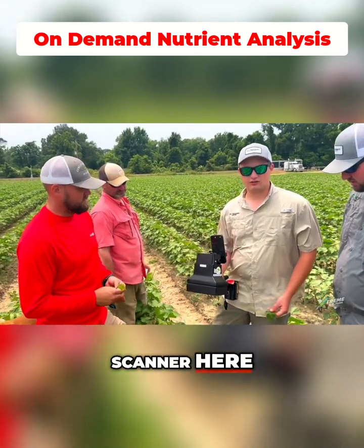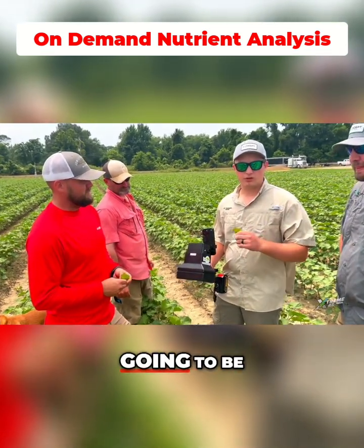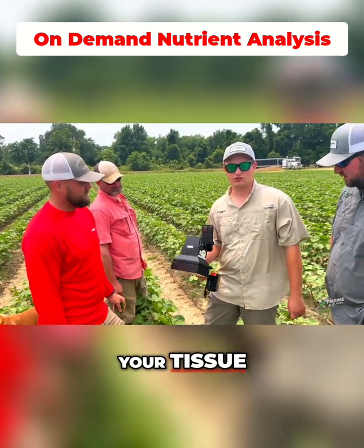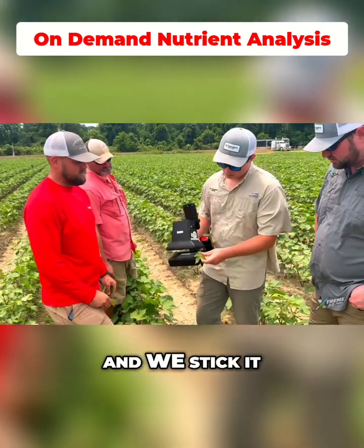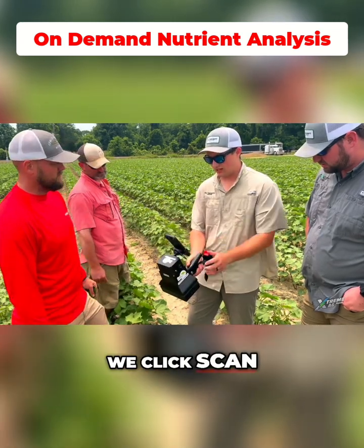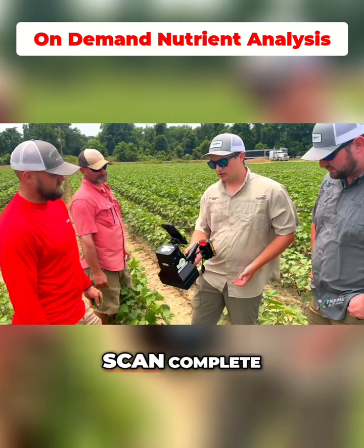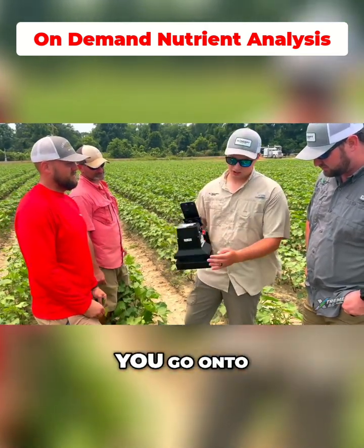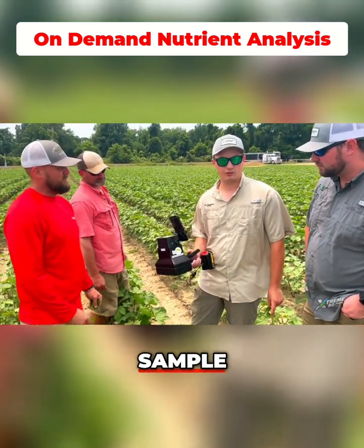All right guys, so we've got our Leafe Tech scanner here. Pretty much how this works is we pull the same leaf that we're going to be tissue testing if we send it off to Midwest Waters or wherever you send your tissue tests. We pull this leaf off and stick it in here. Once we stick it in, we click scan. Then we wait about 10 seconds or so. Once it says scan complete, we click accept. Once the scan's accepted, you go on to your next tissue, and in about 20 minutes it'll be uploaded and we can take a look at our sample.